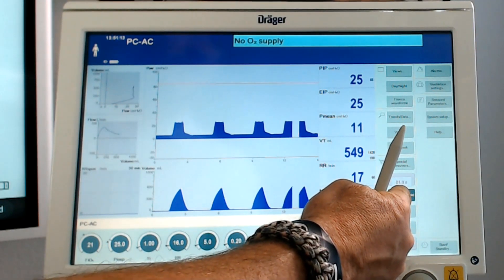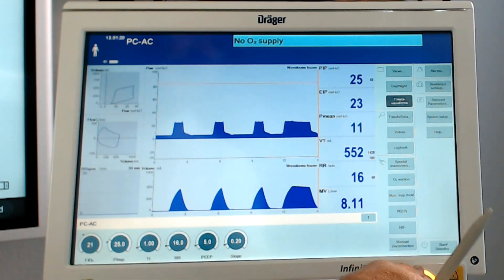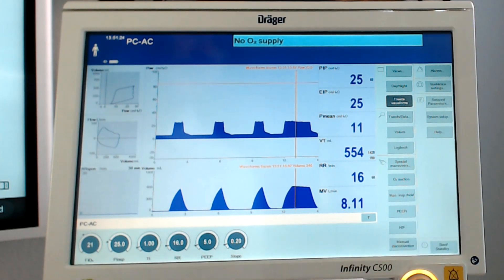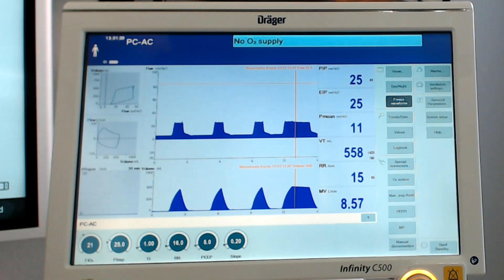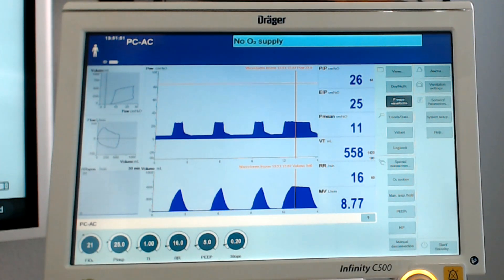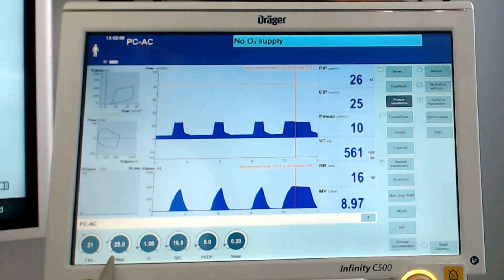What I want to do here is do an inspiratory hold. Notice how you didn't really get a drop in the pressure like you did in volume control. When you tell the ventilator to do an inspiratory pause, you're telling the ventilator to hold that breath a little longer. But when you do that in volume control, it holds the volume in the alveoli, so you see that change in pressure. But when you're in pressure control, the ventilator says it'll hold what it's told to do - and what it's holding is the set pressure.